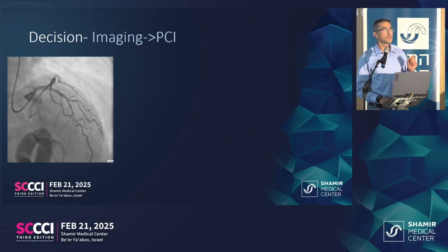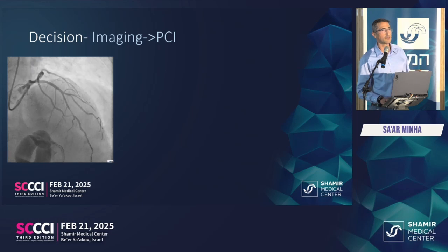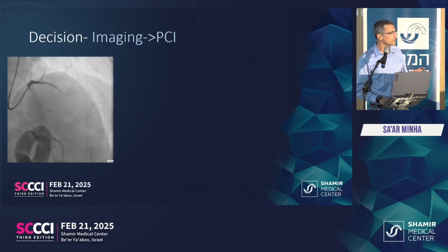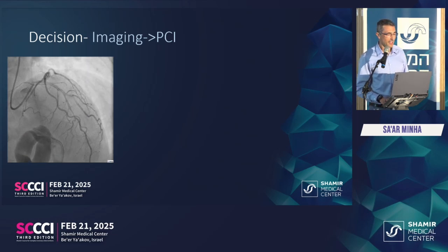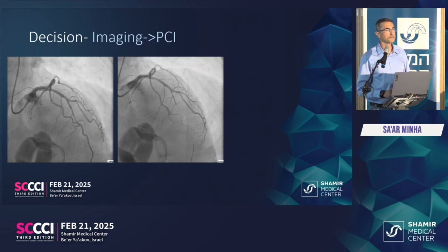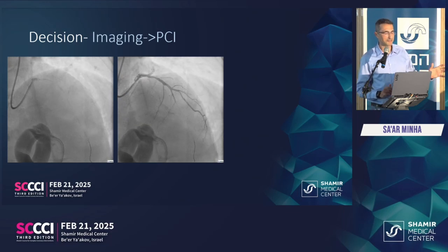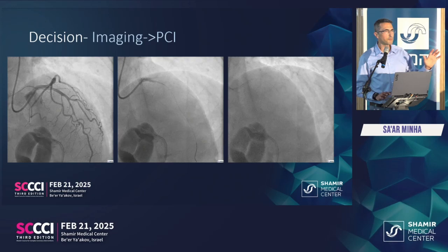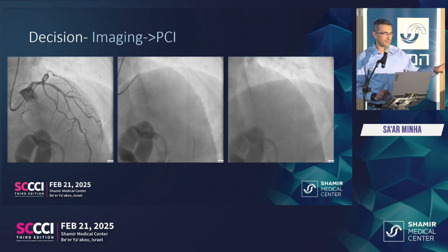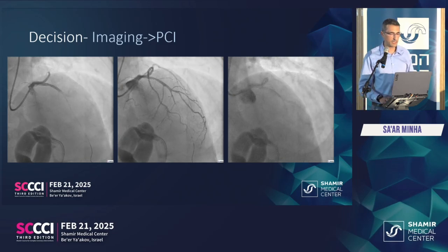And he said, there's a new IVUS by Boston, ultra fast, ultra high res. Just do an IVUS. I said, just put a stent in. He said, no, do an IVUS. So I'm putting a wire. And then I said, why did I listen to him? So I decided, by the time you get in and put your IVUS in, I'll just put a stent in. So we did some nitro, no predilation.